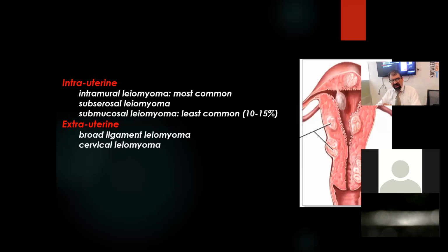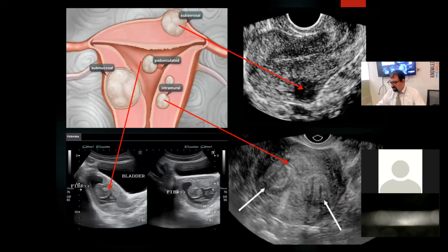Once you go to the gynae ultrasound course, you will find many classes on fibroid in sequence over there. So now see, I told you this is hypoechoic. So this is the fibroid over here. Usually this is hypoechoic, in comparison.